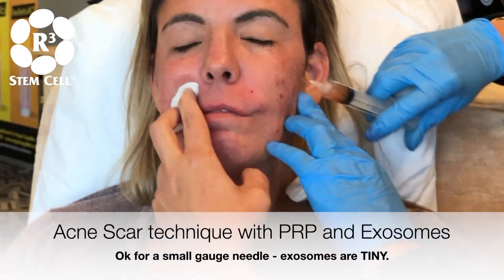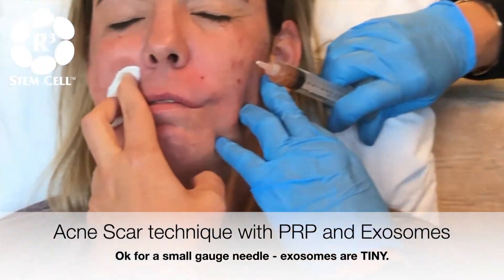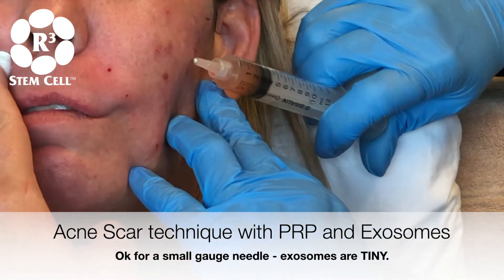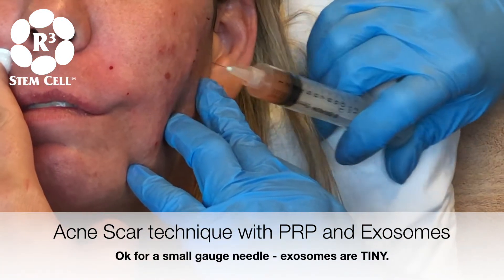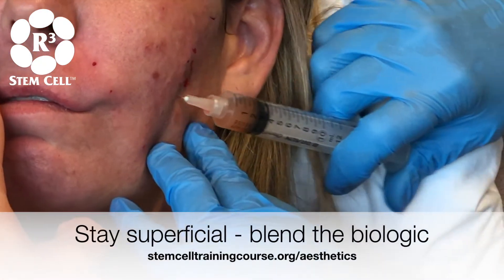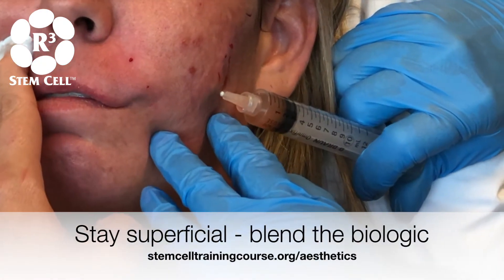Let's take care of all this right through here for you. I'm just going very superficial and I'm just blebbing it and spreading it out around these little acne scarring, so you want to stay pretty superficial with it in the subdermal.